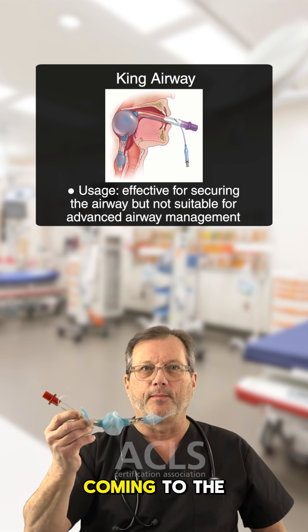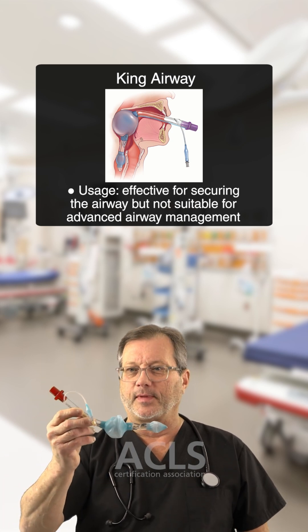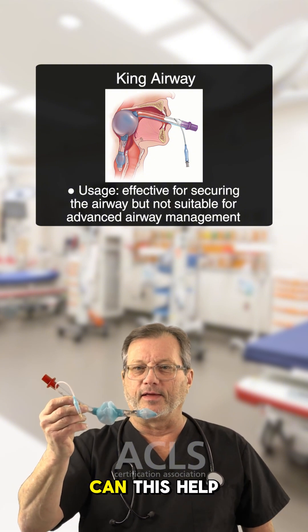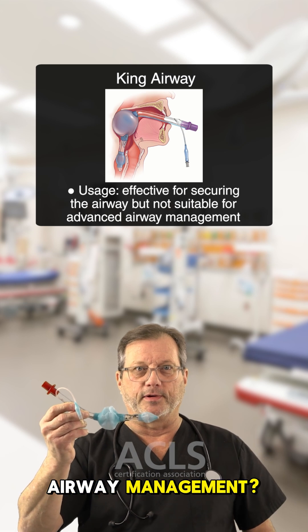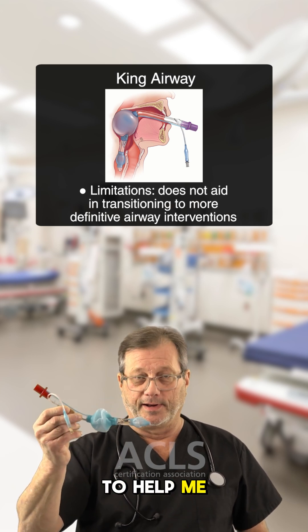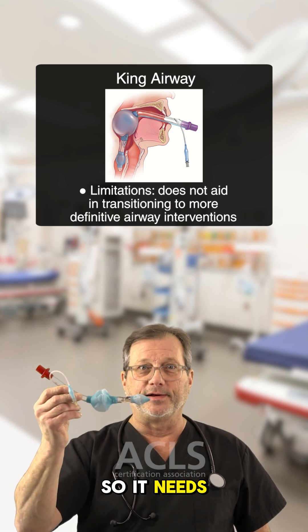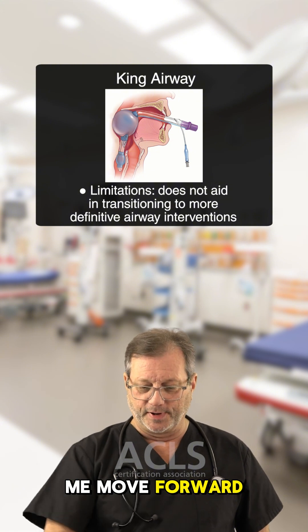I've seen patients come into the ER being very well oxygenated, very well ventilated. Things I'm looking for in the field: can this help me in my next step of airway management? Because if this doesn't work, I need to intubate the patient and there's no way that this device is going to help me — it's going to get in my way, so it has to come out. It needs air to work, a syringe, and it's not going to help me move forward.